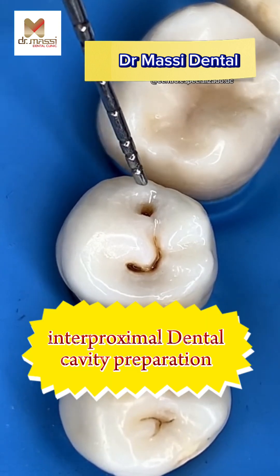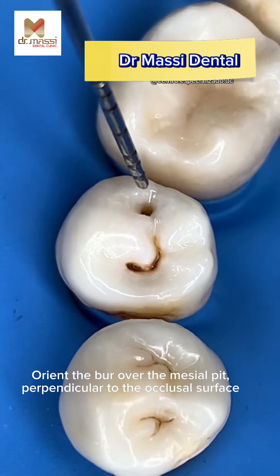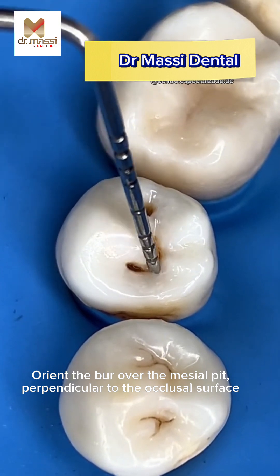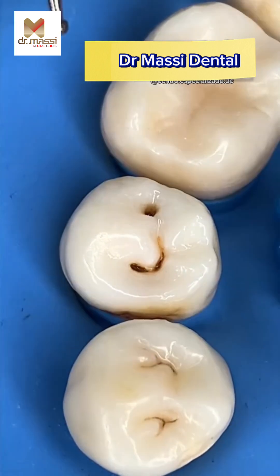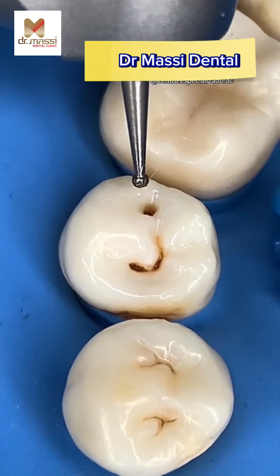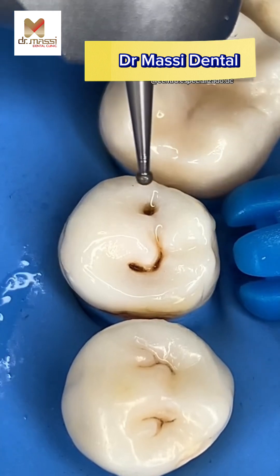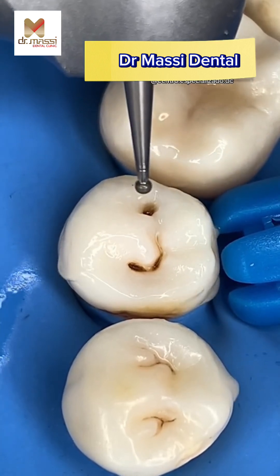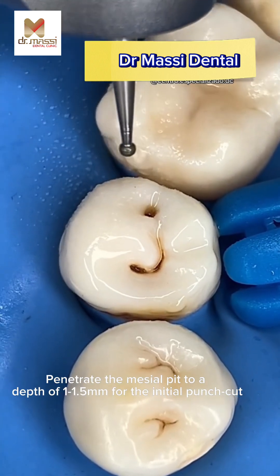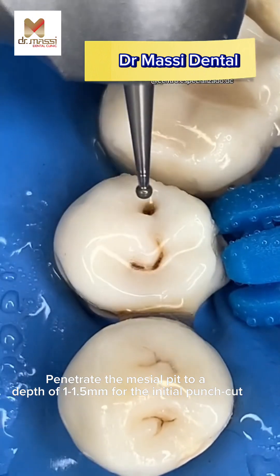Interproximal dental cavity preparation. Orient the burr over the mesial pit, perpendicular to the occlusal surface. Proper isolation, rubber dam. Penetrate the mesial pit to a depth of 1 to 1.5 mm for the initial punch cut.